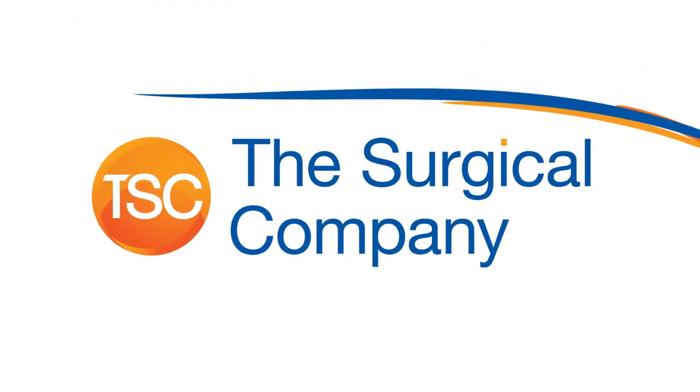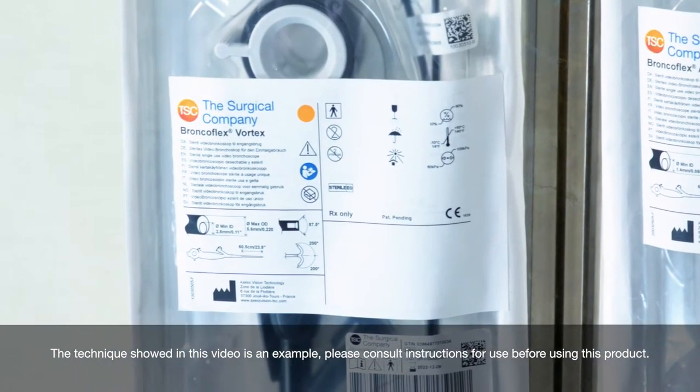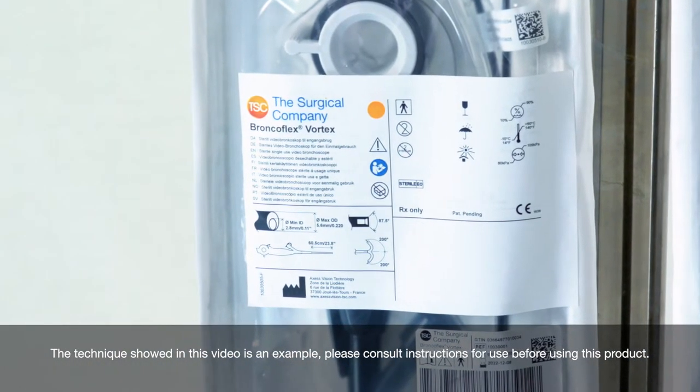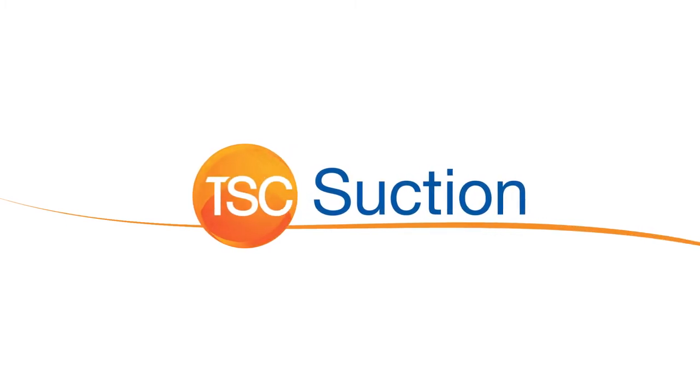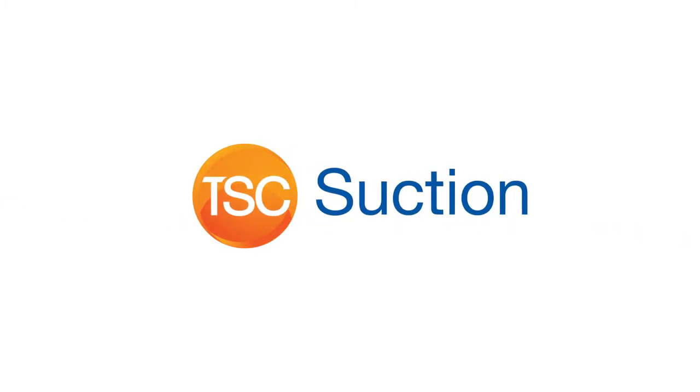The technique showed in this video is an example. Please consult instructions for use before using this product. The bronchial wash aims to clean the airway of excessive secretions.